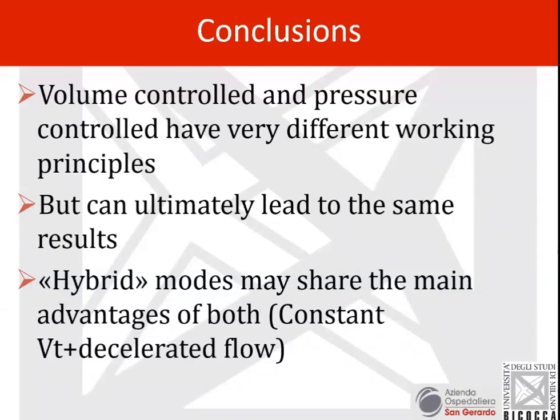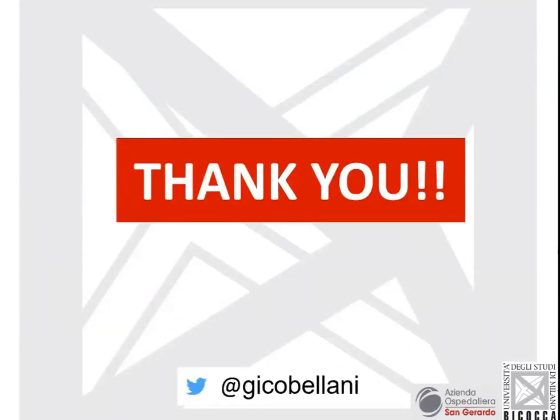And I think that the hybrid modes such as pressure-regulated volume control, which I did not have time to cover during my talk but you will definitely see during the hands-on sessions, share the main advantages of both: a constant tidal volume, which is the key feature of volume control ventilation, and the presence of a decelerated flow. I thank you very much for your attention.